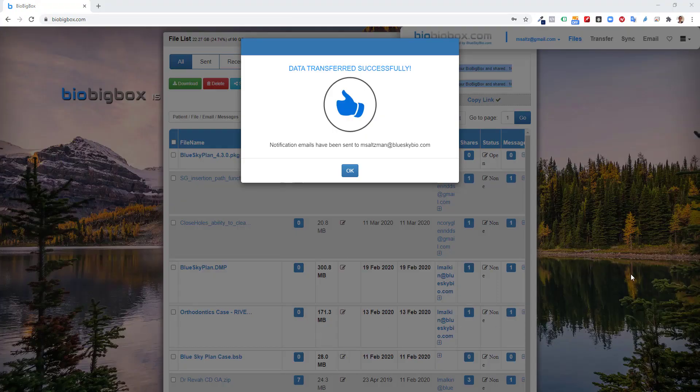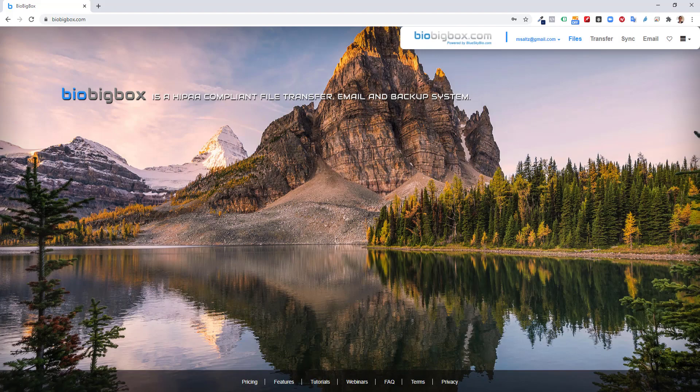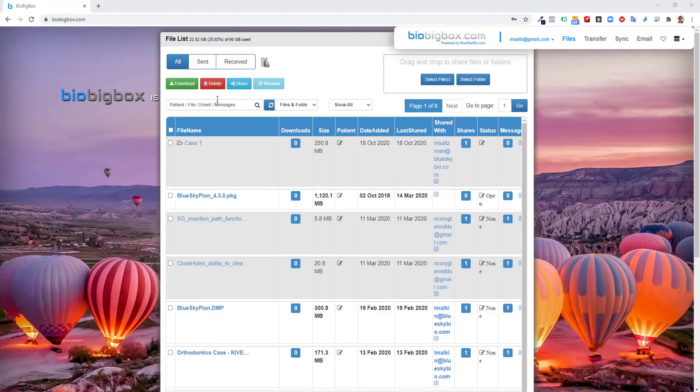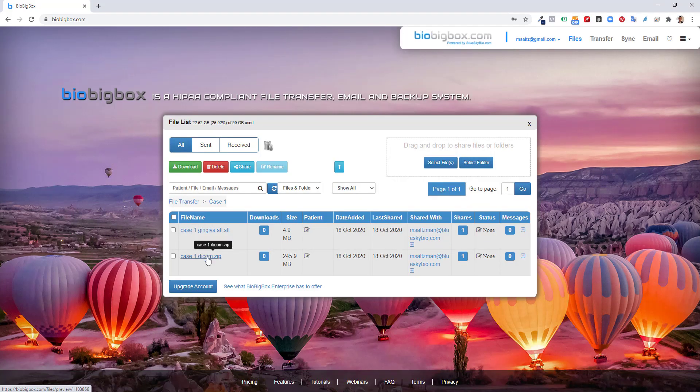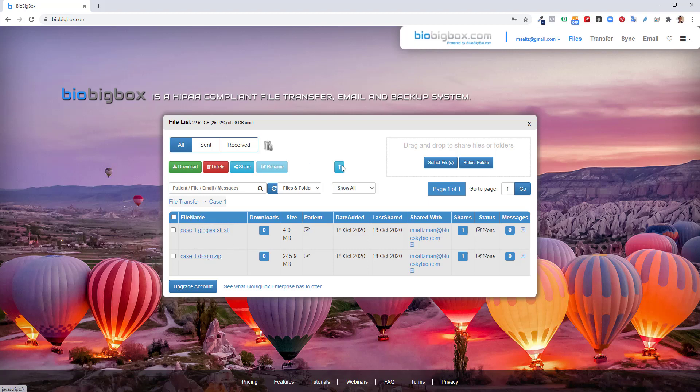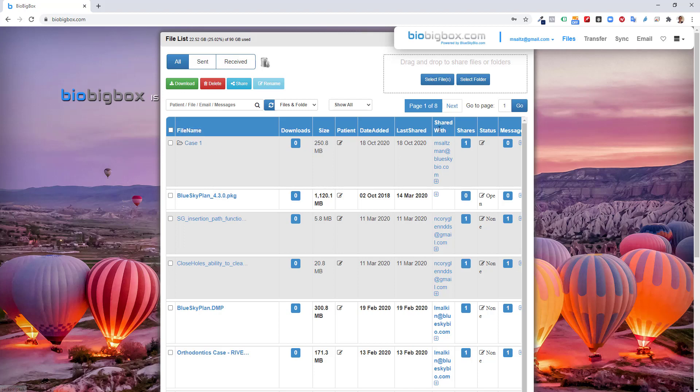So the files completed their upload. I received the notification on the screen that the data is transferred successfully and that a notification email will be sent to msaltzman at blueskybio.com, who is the recipient in this situation. I can now see in my files the case one folder that I uploaded. And if I click on the folder, I could see the files inside the folder. I could click up to go back up to a higher level or click file transfer and takes me back to where I was before. I could see that this folder has been shared with msaltzman at blueskybio.com.